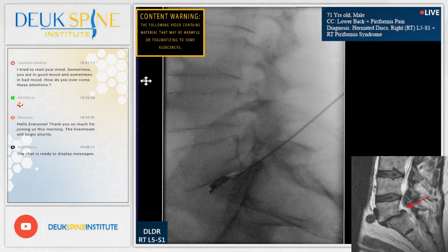Very common problem. But, you know, half the doctors say it needs to be fused, the other half say it doesn't. I'm actually in the group that says it doesn't, as long as you do endoscopic spine surgery like we're doing. But if you're going to go back there and take out bone and ligament, then it needs to be fused. I used to fuse these all the time. We're not taking bone and ligament out. We're coming through the side.